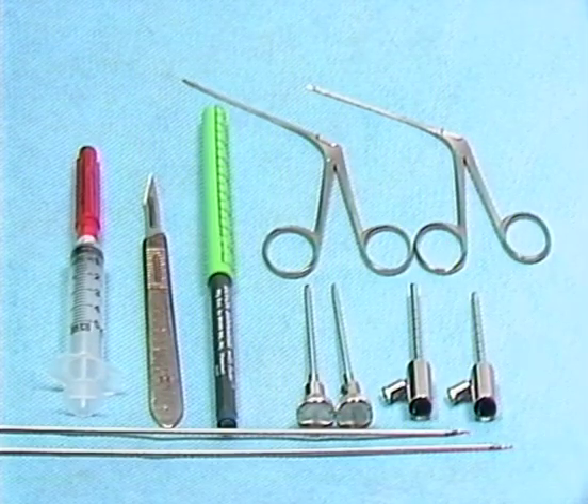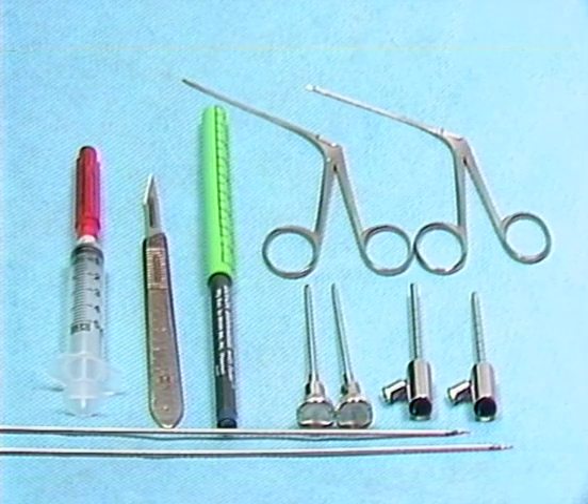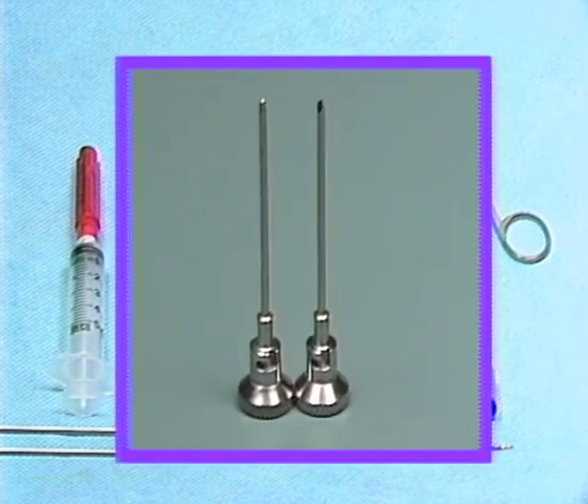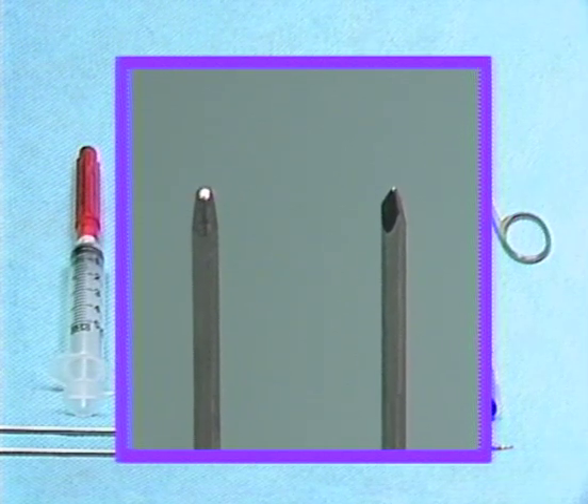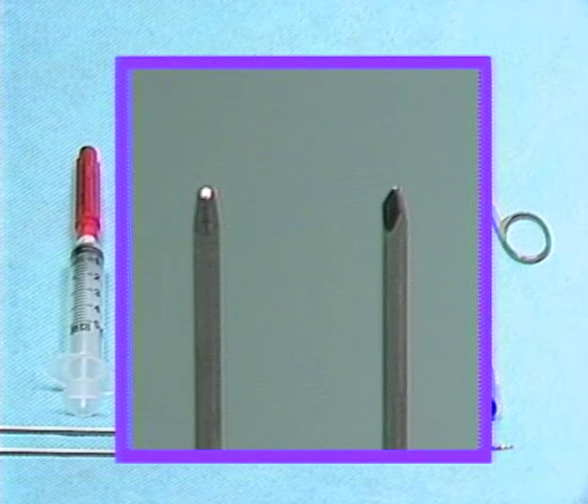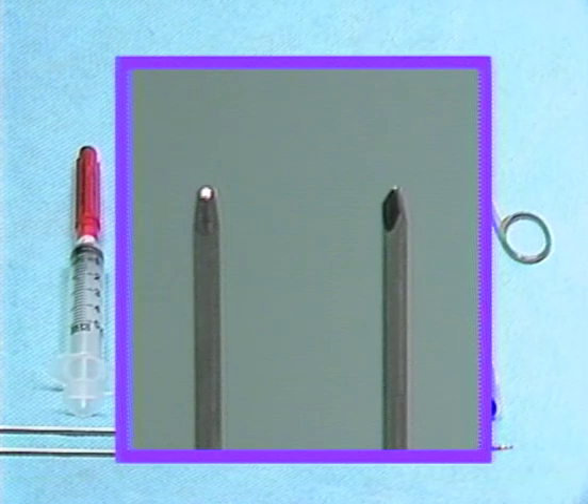Various hand instruments are used for the percutaneous introduction of the arthroscope. To gain access to the joint percutaneously, a trocar-cannula assembly is used. At first, a sharp-ended trocar, seen on the right, enables the operator to puncture the skin, subcutaneous tissues, and lateral capsule of the joint. However, to reduce the likelihood of damage to the internal structures of the joint, the sharp trocar is immediately replaced with a blunt-tipped obturator, seen on the left, once entrance is gained into the joint space. Both the trocar and obturator are secured to the cannula by a J-lock fitting.